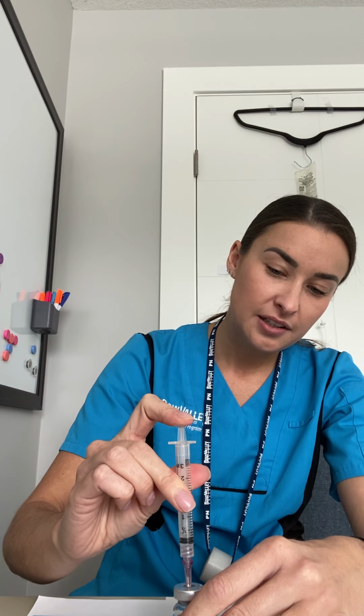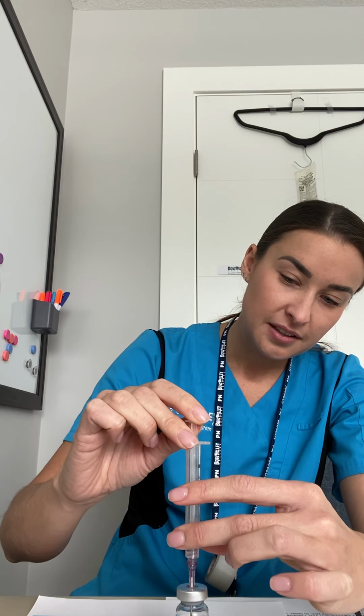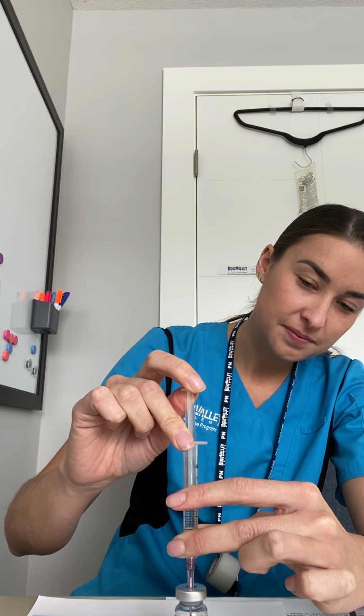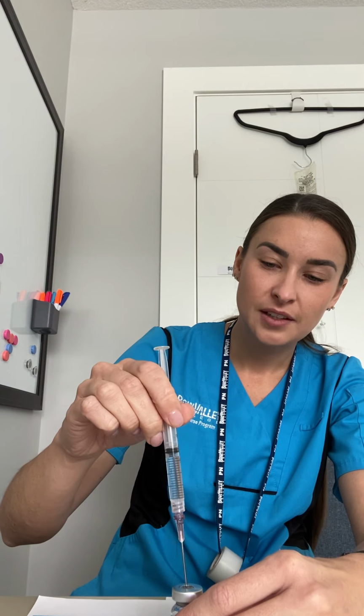Push the air in, and then we will also expel that amount as well here. Okay. So we have the medication drawn up here. We just want to put all the bubbles to the top here. Perfect. And then we're just going to expel the excess medication, I guess you would say. We don't want it dripping back down the needle, so keep it on an angle here. We want 1 ml.